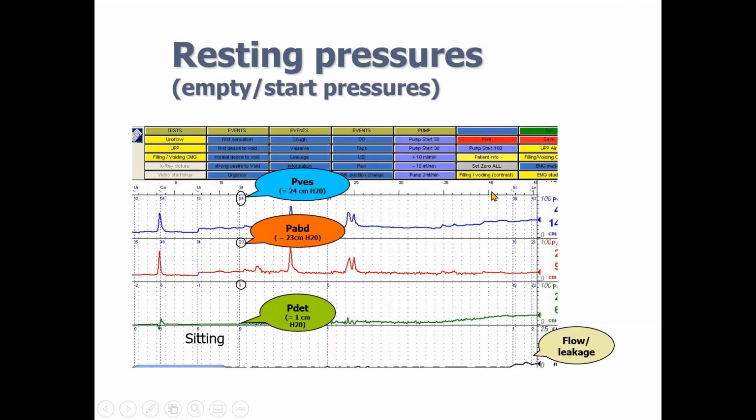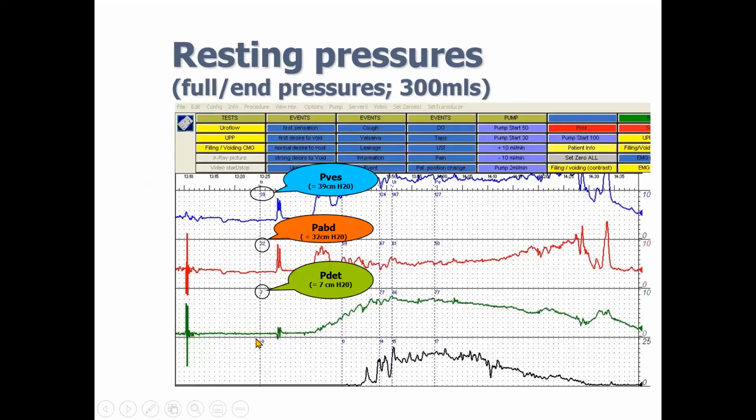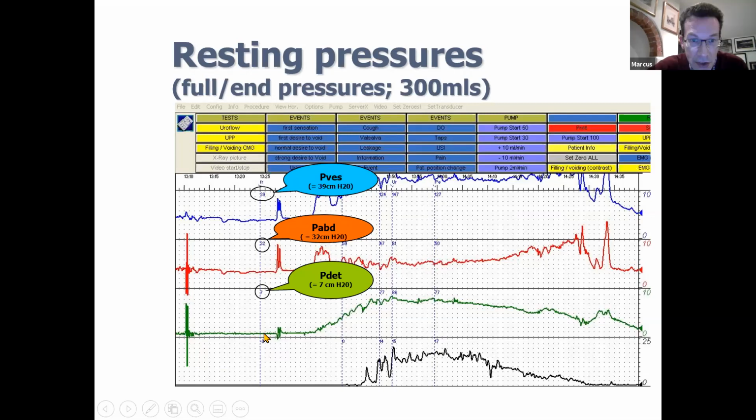Yes. So if you compress that into the more compressed time scale that you're used to looking at, this would look like detrusor overactivity. So I think you're being a bit misled by the time scale. You're thinking that looks like poor compliance, but actually this is detrusor overactivity at a broad time scale. I guess you're probably much happier when you see it like this.